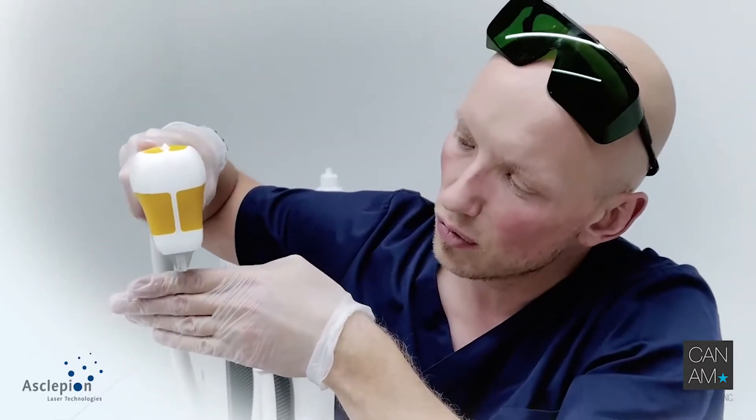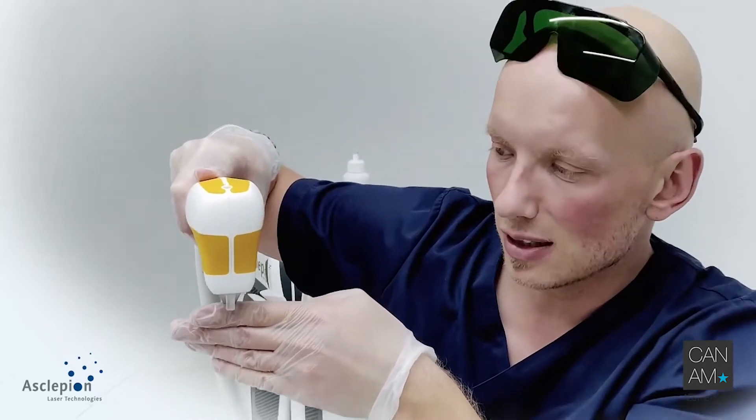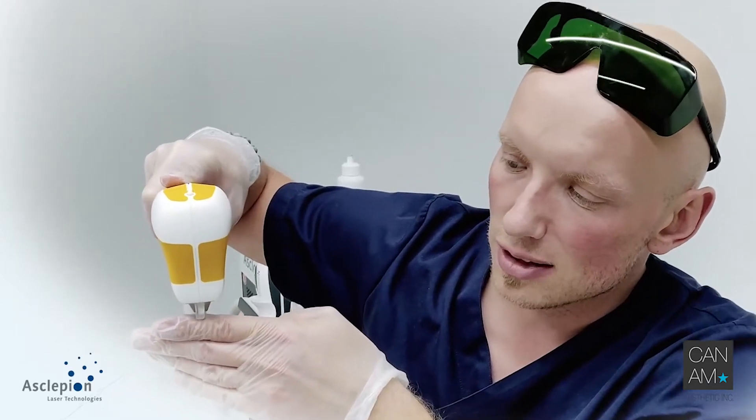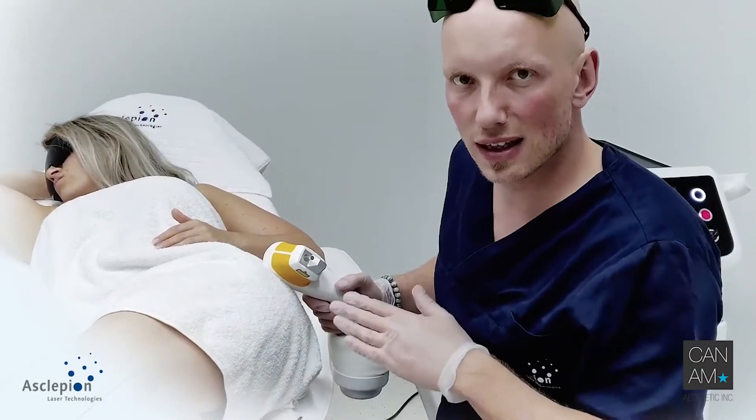This is the clinical endpoint you would like to see. If you watch very closely, you can see it might be that there is a little dark area which is coagulated hemoglobin. And this is where you spot next. For vessels which are deeper, you go for a perpendicular kind of handling — that means 90 degrees. If you have deeper vessels, deeper indications, deeper locations, otherwise you go for something like 45 degrees, and you are always treating upstream. You are starting where the vessel goes to where you can barely see it, and then you go upstream.